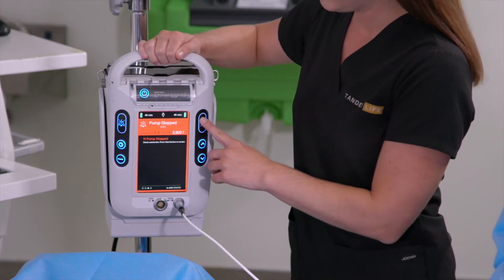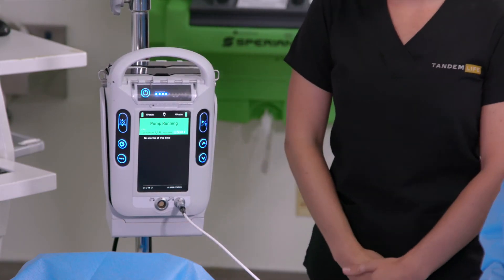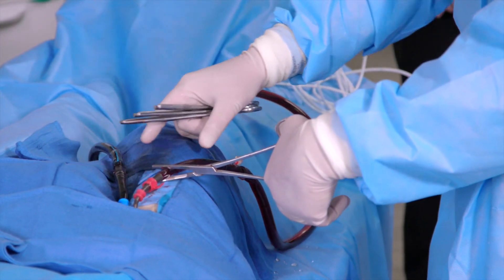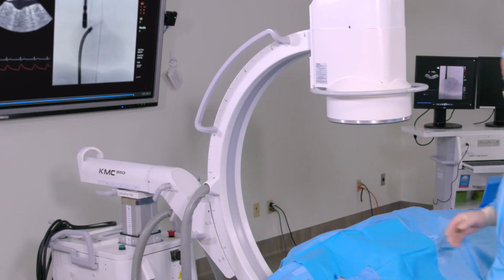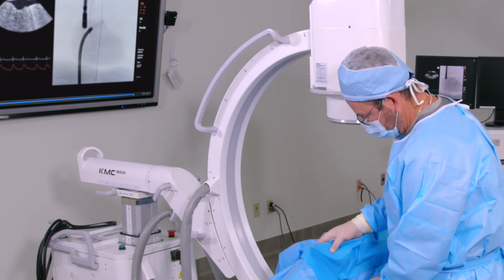Start the pump, which will start at 3,500 RPMs. Check for air bubbles. If the tubing and pump are air-free, slowly release the clamp on the outflow cannula. Gradually increase the speed of the pump until the desired level of flow is achieved. When appropriate, remove the sterile drapes from the cannula insertion sites.